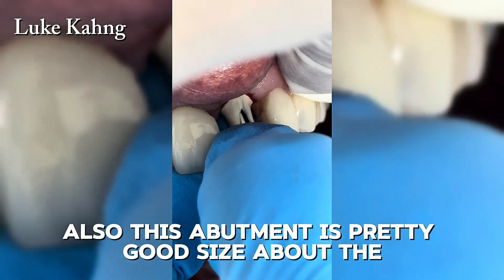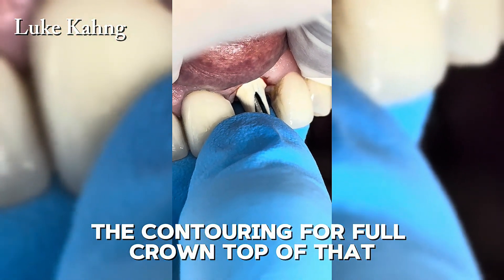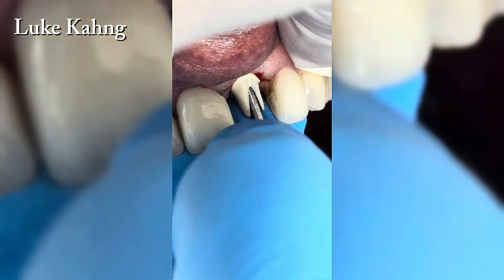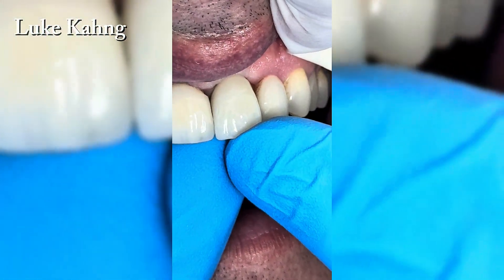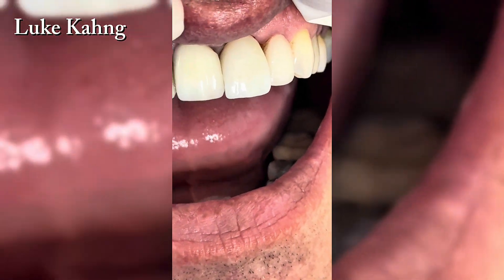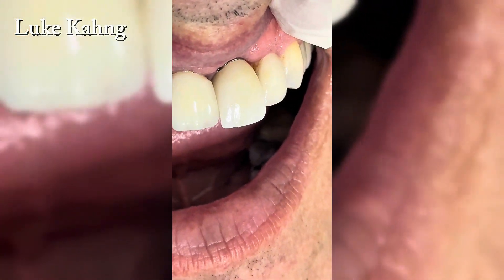This abutment is a pretty good size in terms of contouring. For a full crown on top, the contouring is just very essential. Now trying in the final restoration, which is at the staining stage.